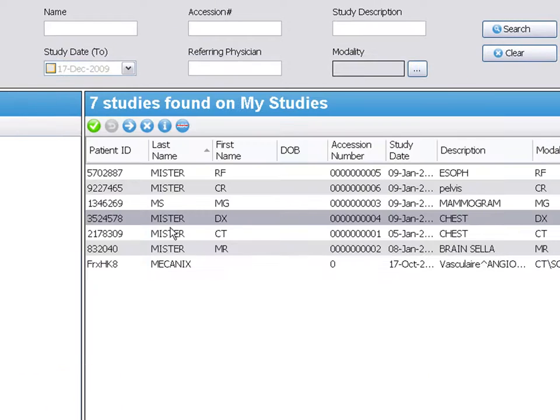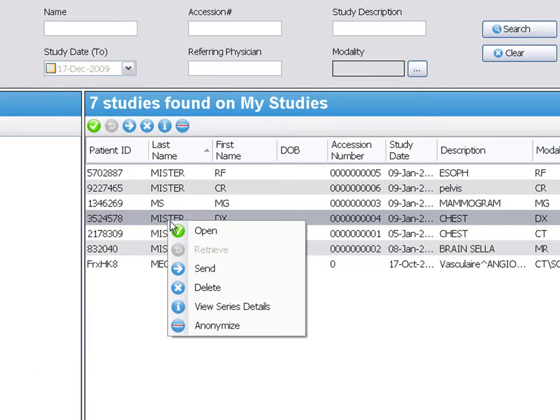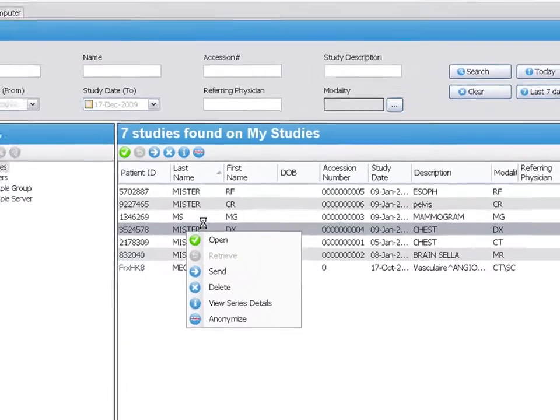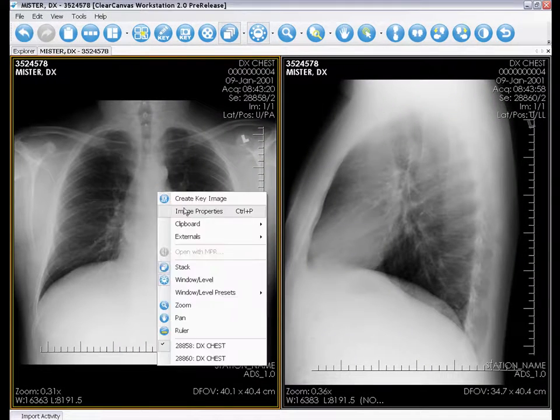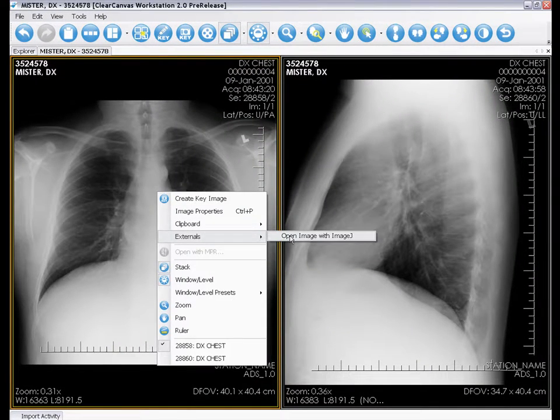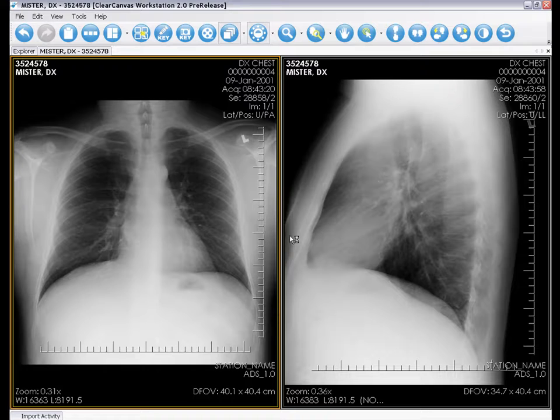Now, when I open a study, I can select an image, right-click, select externals, and click Open Image with ImageJ.